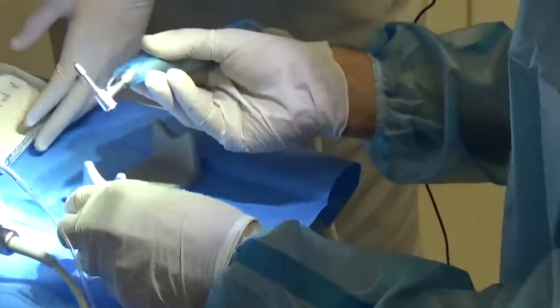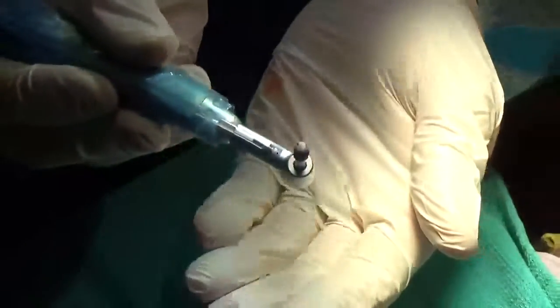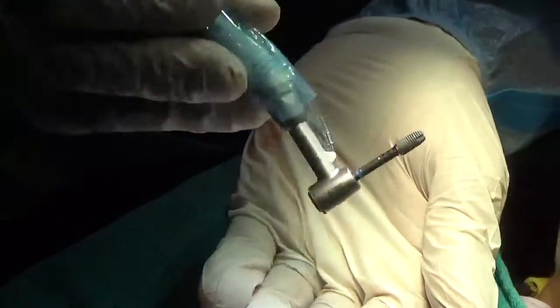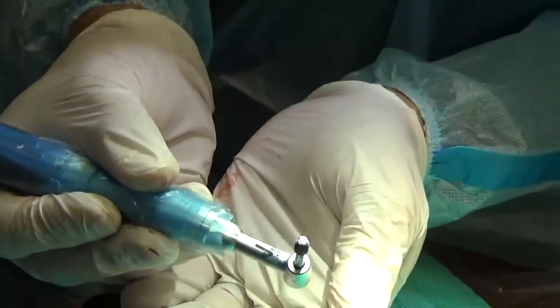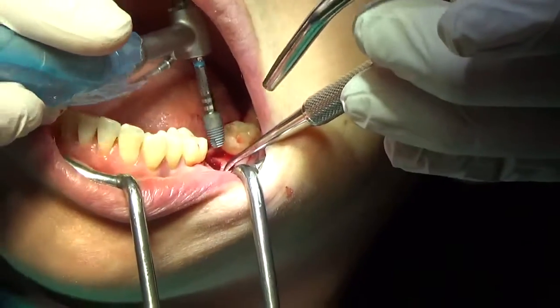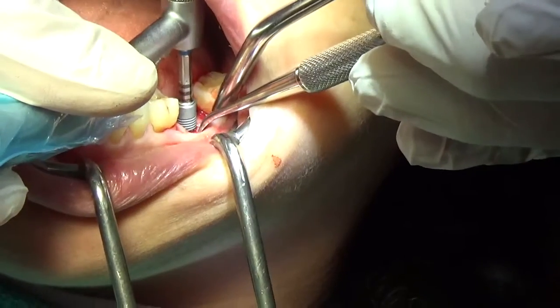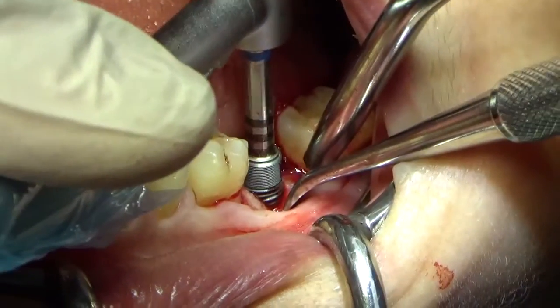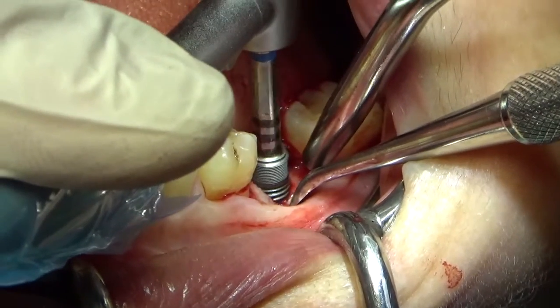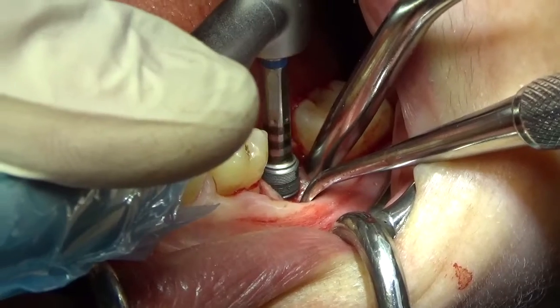So the Astra implant actually only fits in a certain way in the driver. The one thing you want to do is make sure it is not falling out. And anytime you're moving this, you always want something under it. You don't want it to all of a sudden fall where it shouldn't go. But I'm still going to do my best to look at it from both buccolingual and mesiodistal just to make sure it goes down all the way. It's going down. I like the angulation. Going.